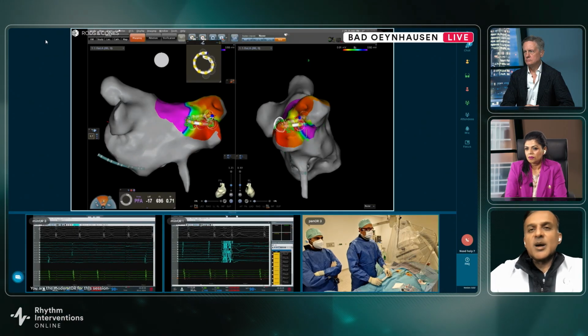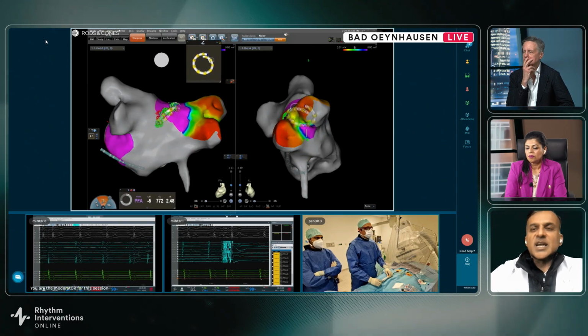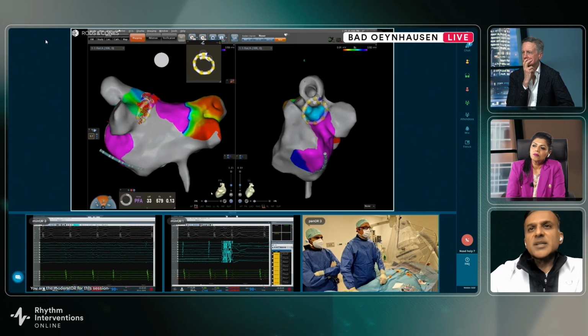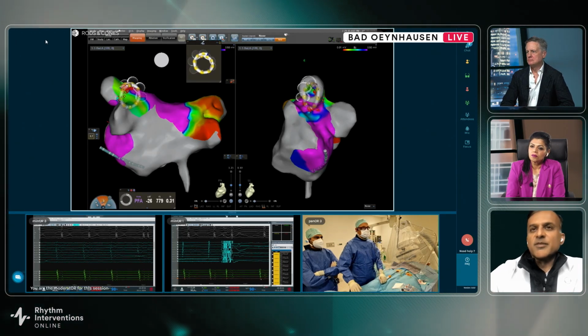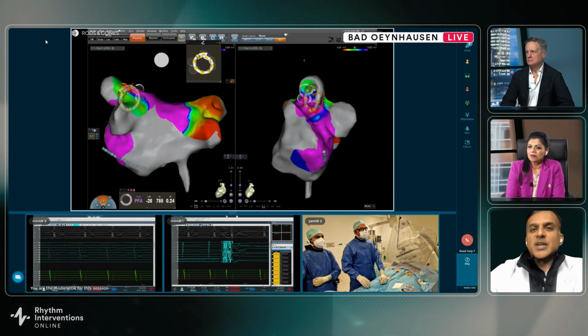We haven't had any complications at the 30 either. Even if you're giving 16, 18, 20 applications and you're only giving that 30 cc flow rate for about a minute, it's not a tremendous amount of fluid load, unless certainly they're very fragile heart failure patients. So I think you could probably get by with either one.